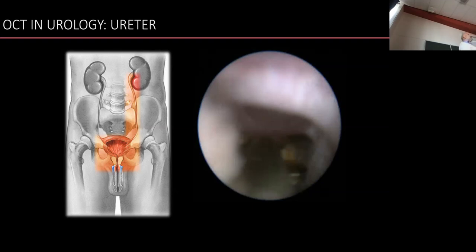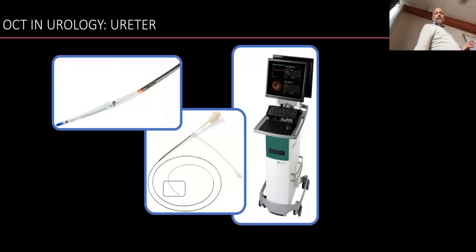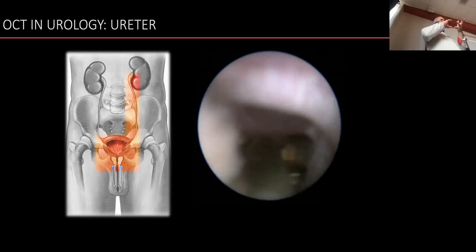This biopsy tool is under a millimeter. It has to go through the working channel. But the pieces of tissue that you get out are even smaller. And the smaller the piece of tissue, the harder it is for a pathologist to give you an answer on what is actually going on there, because it's harder to process and harder to create those microscopic slices. With this tool, you basically yank it out, all these cells become mingled, and it's hard to give you an answer.